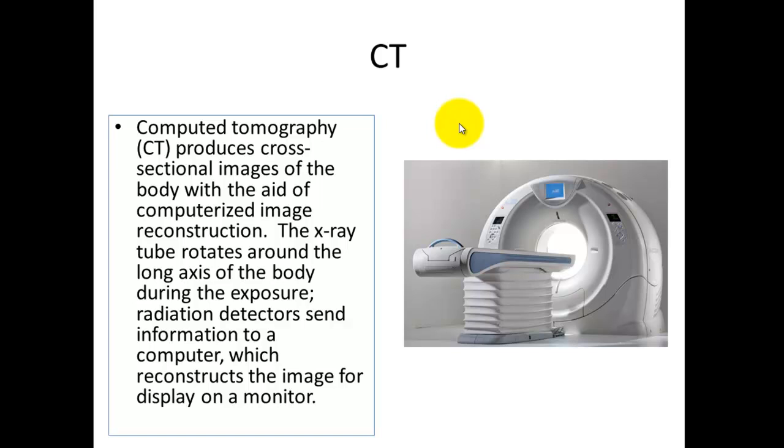That projection data is then manipulated into just one image. Yes, we're talking about 1,000 sets of data turning into one slice. And then multiply that by the number of slices you may have in any particular study. That image is then reconstructed, sent to a specialized computer, which we'll go over in a second, and then finally onto your monitor screen for your viewing.